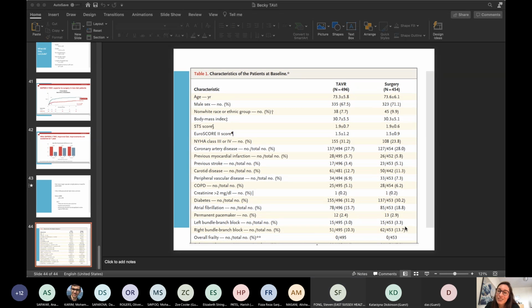I know that we discuss patients in an MDT setting, and it's partly the anatomy that helps you understand whether it's going to be practical to deploy a TAVI inside the surgical valve rather than needing to consider redo surgery. It's also partly about what else might need to be done. Is there other significant valve disease or coronary disease that can't be intervened on unless you do open heart surgery? So that's my cop-out answer, sorry.